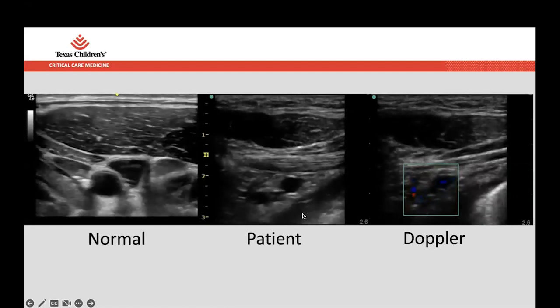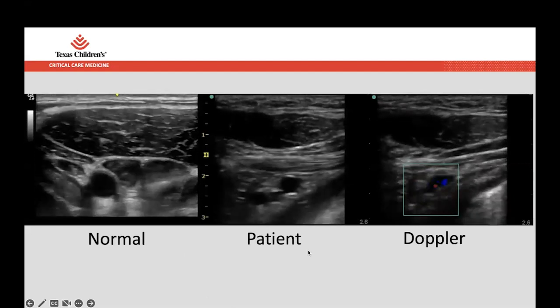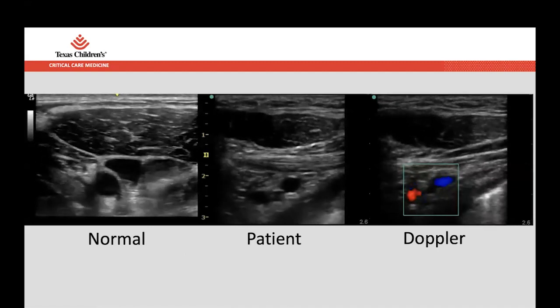And so subclavian artery here, more towards the head, subclavian vein right here. You can notice that they're pulsating out of phase with each other. And of course, if we're looking at putting a line in something and you see it pulsating, you always stop to wonder about it for a moment.